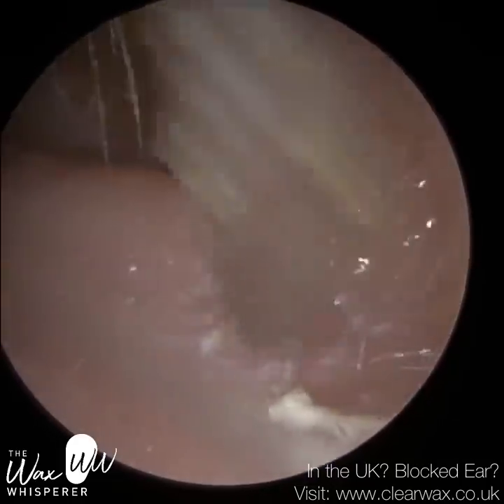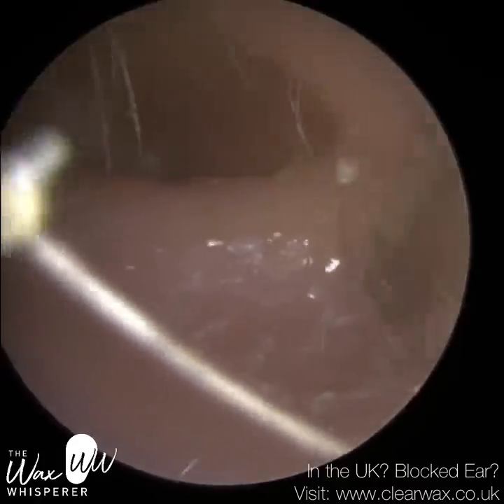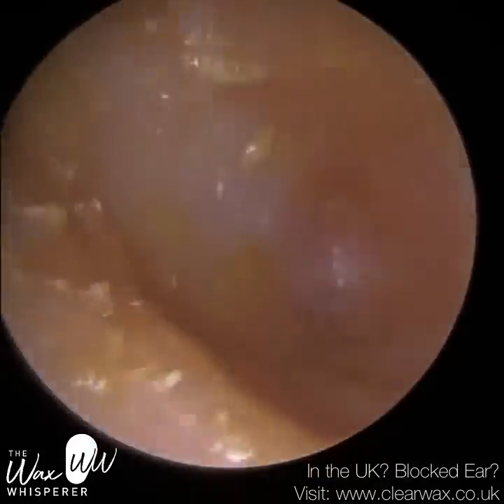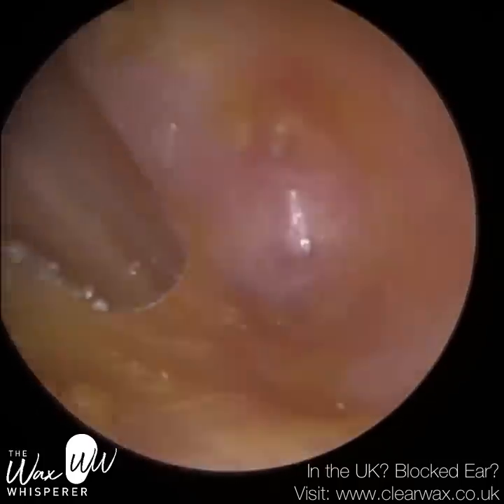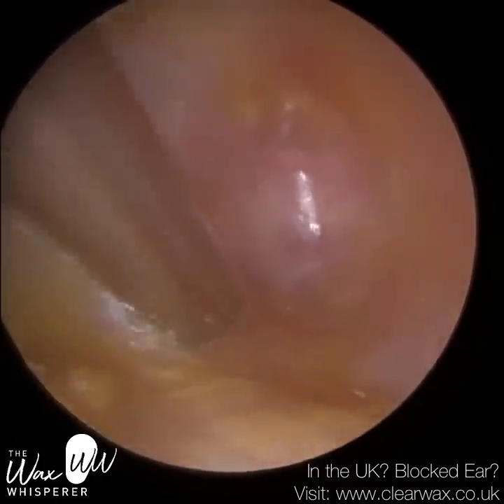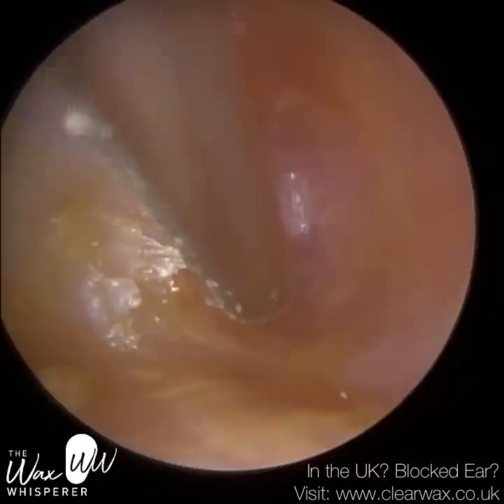And so we refer to ENT because they've got a canal cholesteatoma, of course. And when they arrived, the ENT surgeon, using some local anaesthetic, managed to stop the formation of the false fundus. So before it completely sealed the ear canal, they were able to remove it. But unfortunately, it keeps coming back.